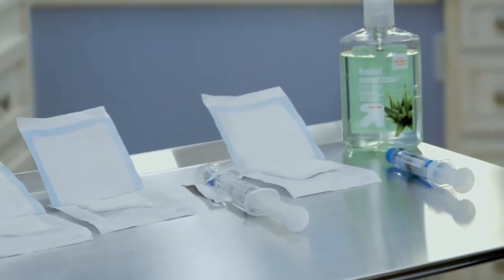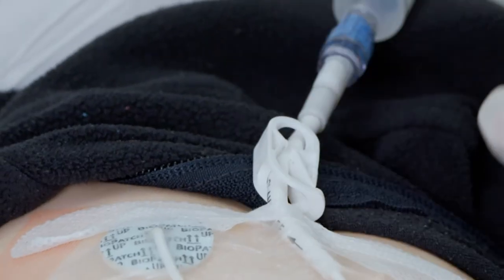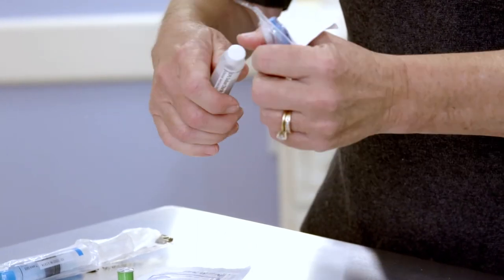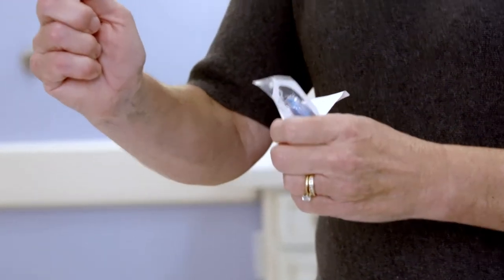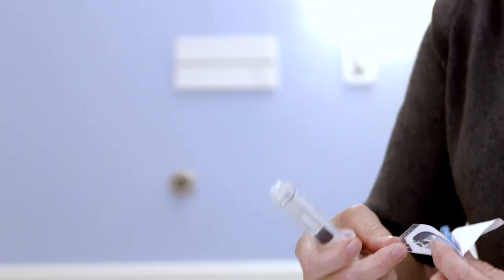You're now ready to change the Needless Connector. Before you start, make sure that the CVC is clamped. Then, open the Needless Connector package — be sure not to touch the Needless Connector. Keep the Needless Connector inside the package. Screw the normal saline syringe onto the new Needless Connector, keeping it inside the package.